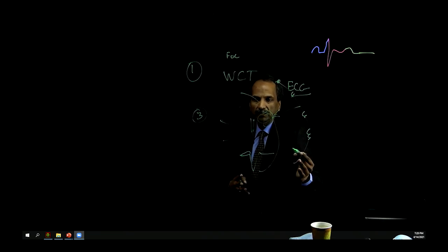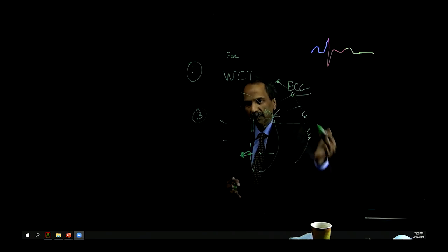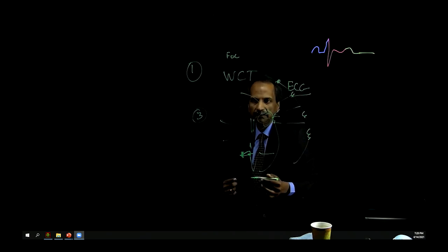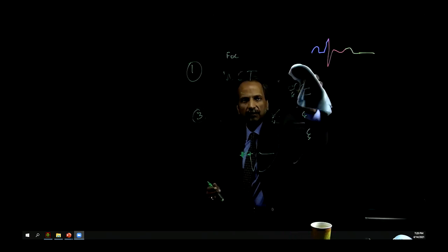So how do we use the unipolar to record at that time? One way to do that is to see on the unipolar what is the timing for the starting of the R wave. So we see this, which coincides with our bipole, but we use this to try and figure out where we will be opposite to that early site and could potentially ablate if we are not actually getting epicardial access.